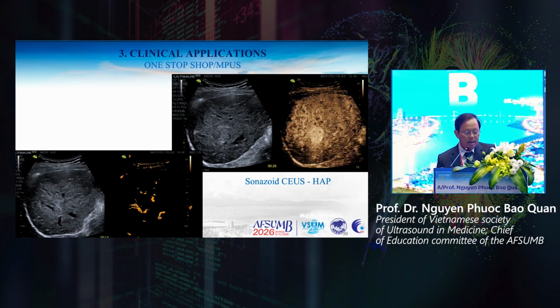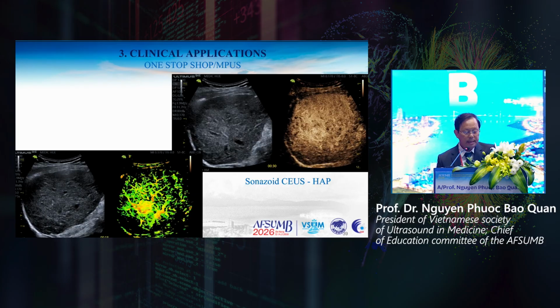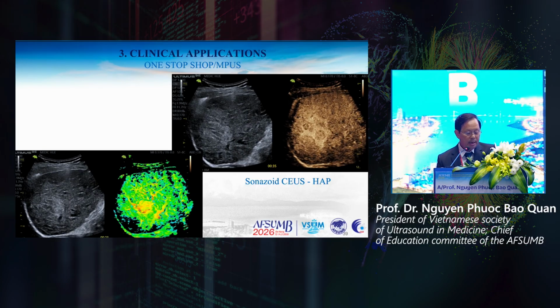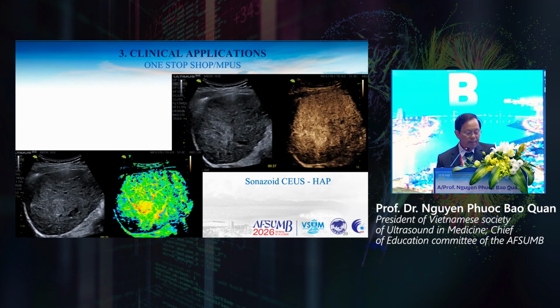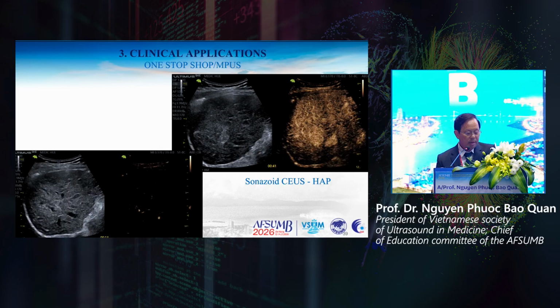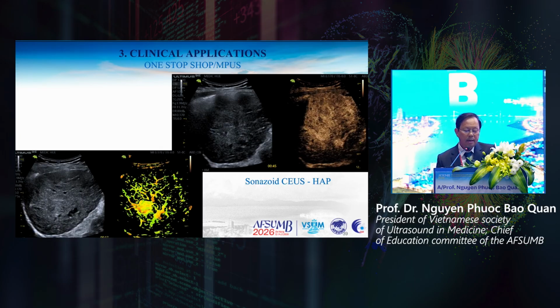After that, at the end of the portal venous phase, you can see the washout of the lesion, and in the delayed phase, you can see continual washout.